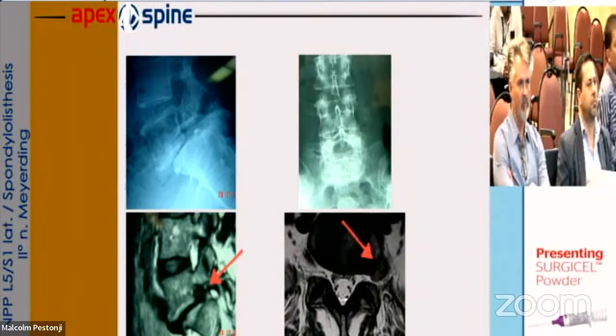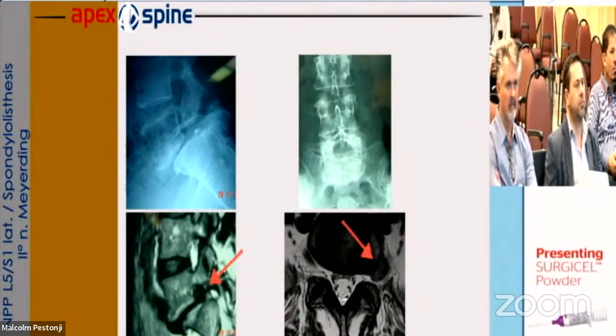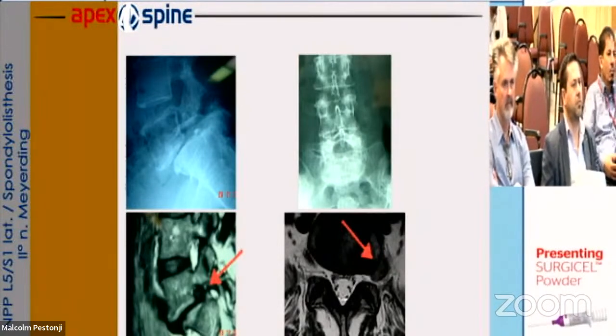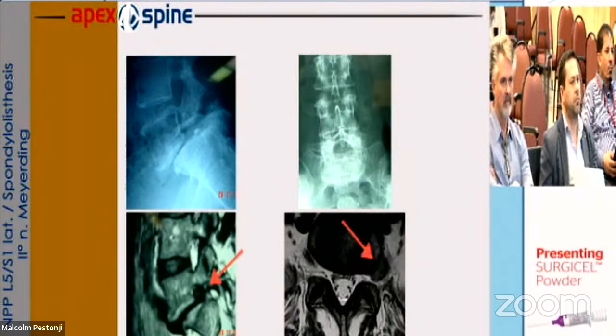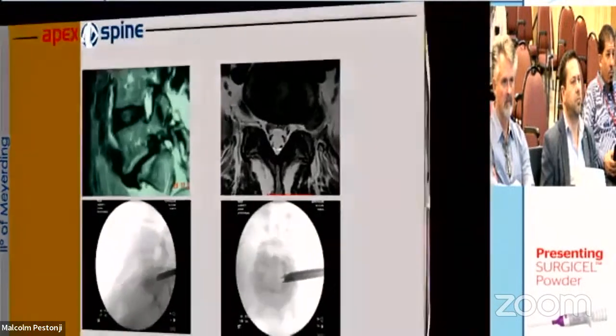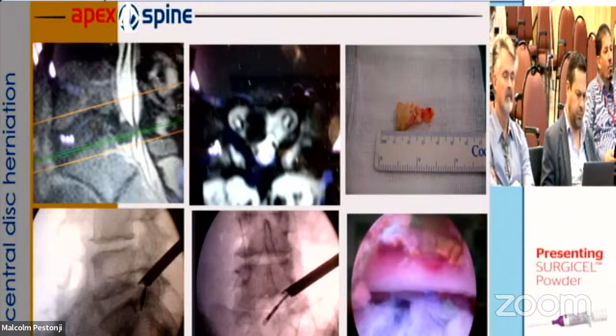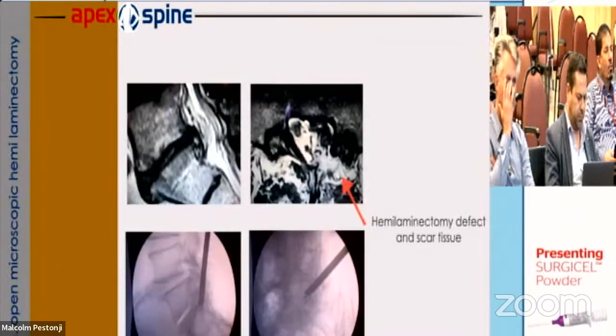And here you see a spondylolisthesis. The patient was a colleague, around 70 years old. It never gave him a problem, slight back problems, and now he suffered mainly from leg pain. All the colleagues wanted to fuse him, and I just removed the extraforaminal disc herniation, and now he's happy. Yes, you see the pictures. It was a little bit tricky because the disc herniation is stuck between the traversing and exiting nerve root. For that, I used a higher approach to level L5-S1, and I used a bended forceps.